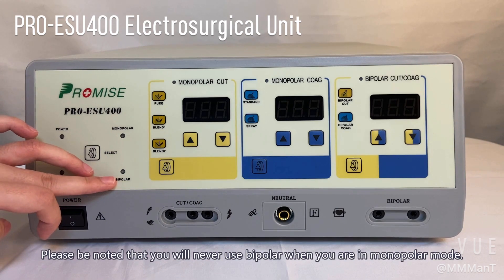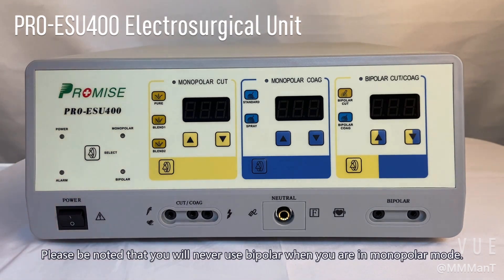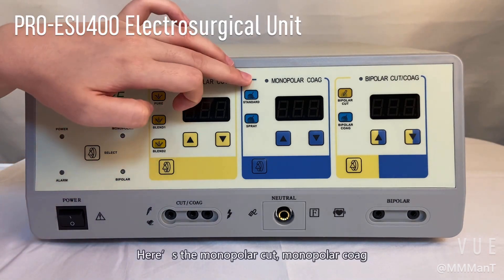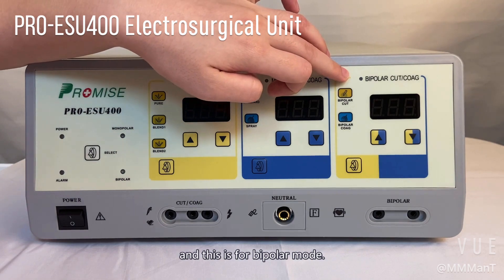Please be noted that you will never use bipolar when you are in monopolar mode. Here's monopolar cut, monopolar coag, and this is for the bipolar mode.